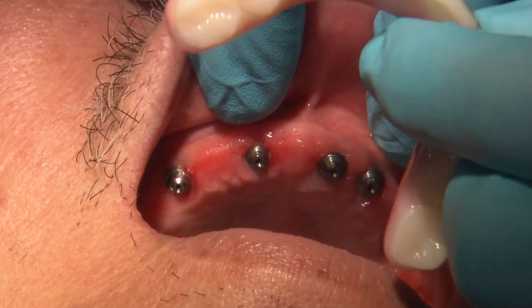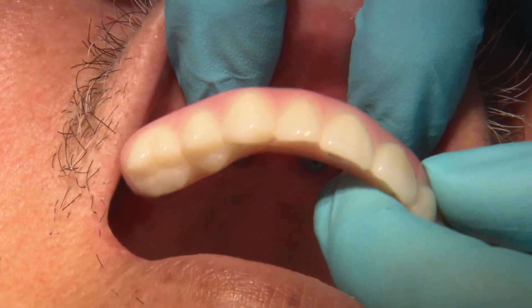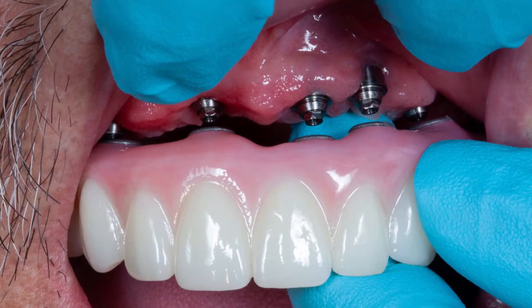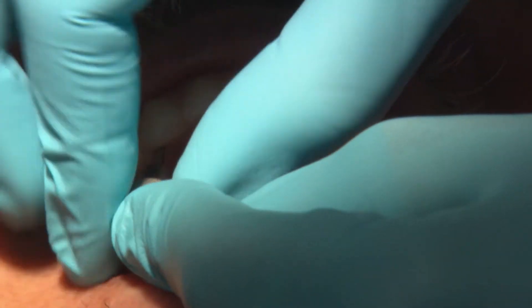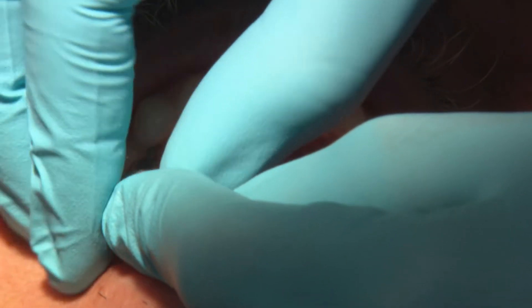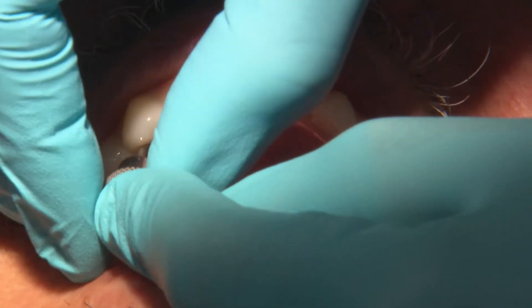When seating the definitive Bruxer full-arch prosthesis, just as we did with the PMMA, I like to lightly hand-tighten each screw. You should not feel resistance. If you do, make sure the top of the multi-unit abutment is clean and the screw channel is free of debris.